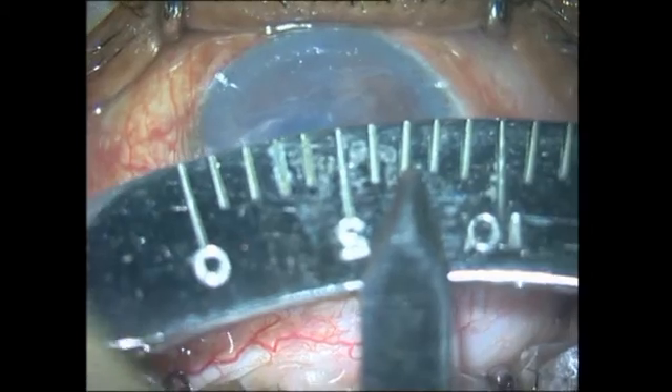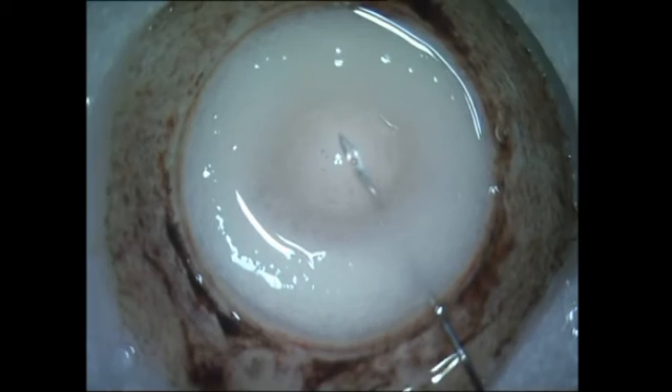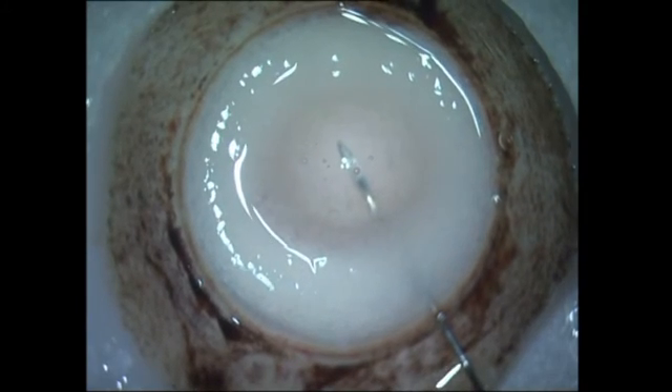Here's a patient who had pseudophakic bullous keratopathy. What I do first is estimate the graft size that I would be requiring and then I go on to prepare the PDEC graft.